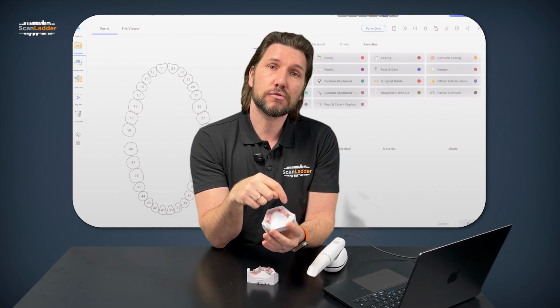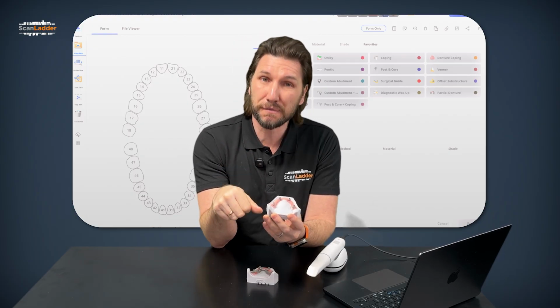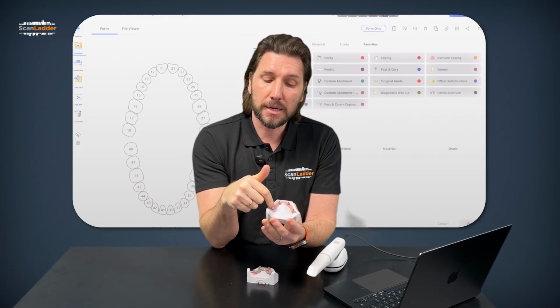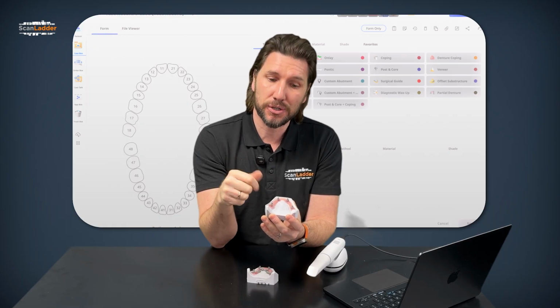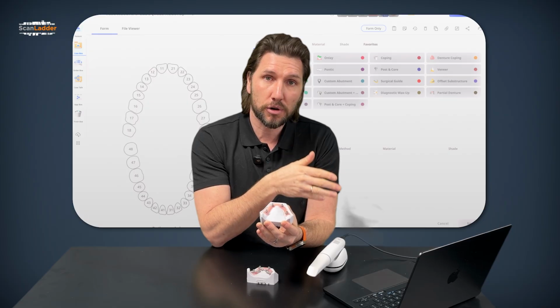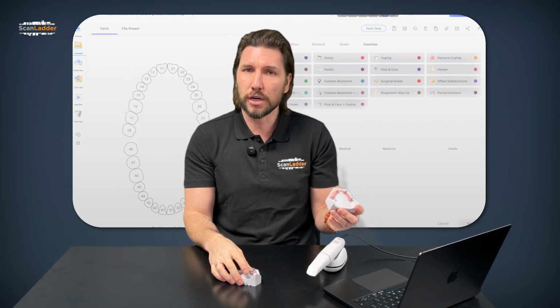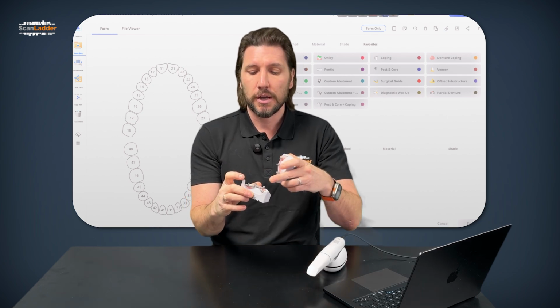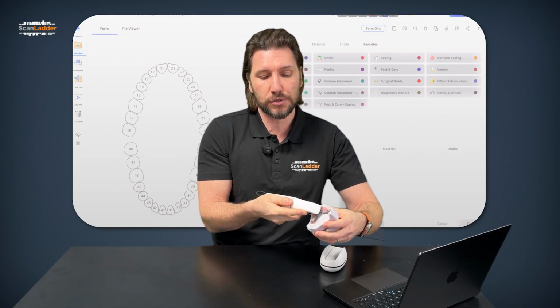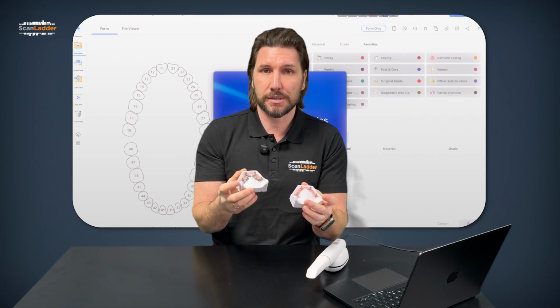The benefit of having these random shapes, unique patterns on each one of these cylinders means that as you're scanning the soft tissue, it helps the accuracy, number one, but also it makes this soft tissue scan easier. So as you scan around, the benefit is there's no duplication. And we'll see that when we try this out in a sec. But the key point for now, before we actually start scanning, the difference between the 2 is the horizontal sections that reduce the frame from which the scan starts. So it's all starting from the middle. And this is a lower arch model, okay? But the cylinder is the same between the 2.